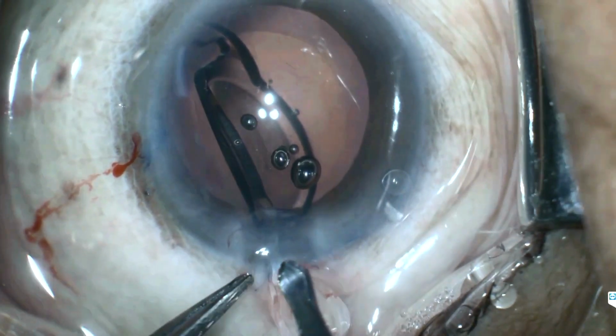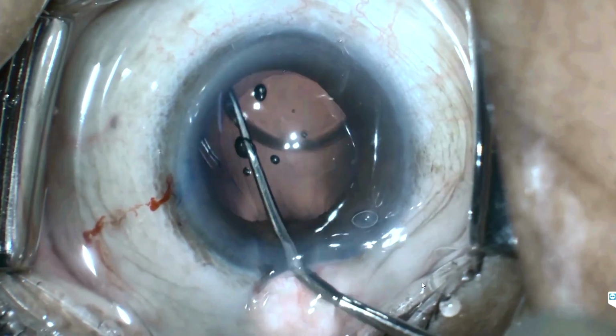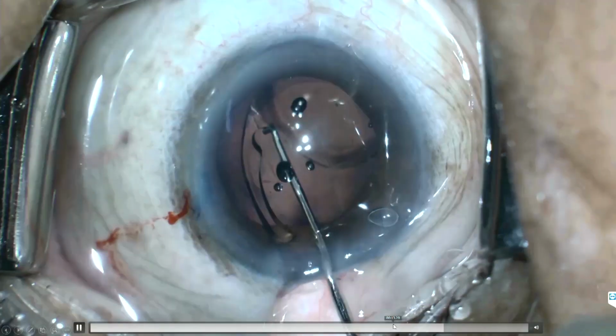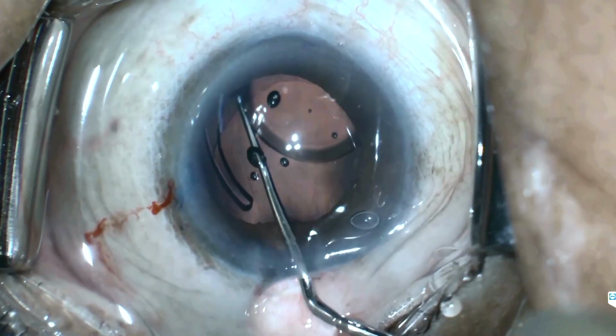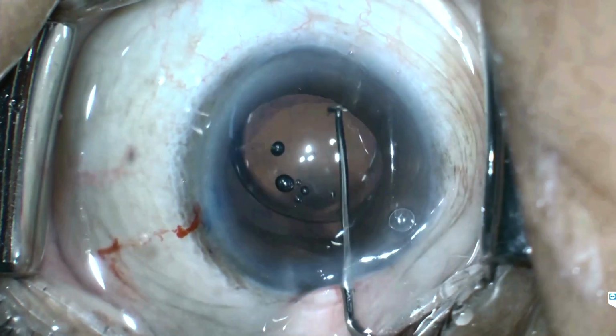Just take a McPherson, hold the haptic and pull it. It comes very easily, and then you can inject it. If you retract the cartridge, it will snap off the tip of the haptic.